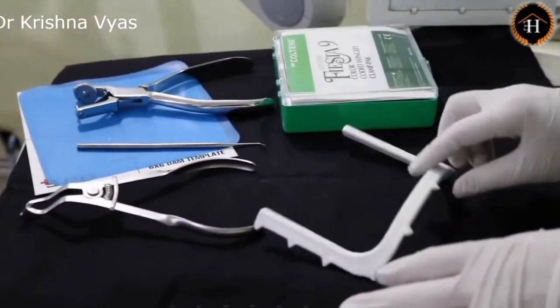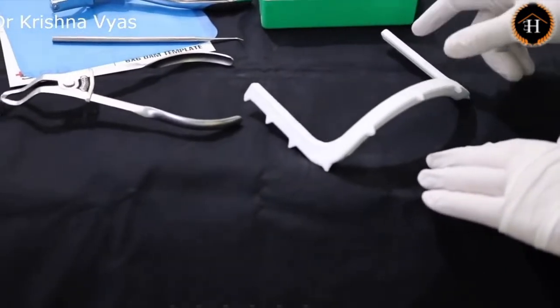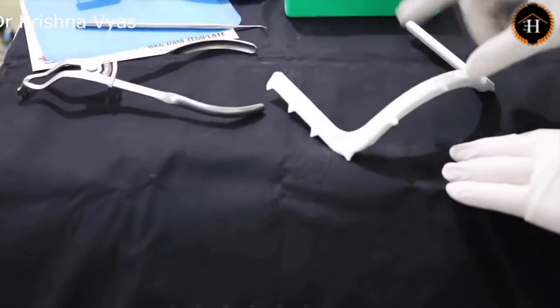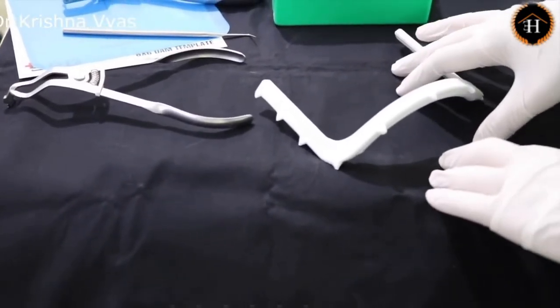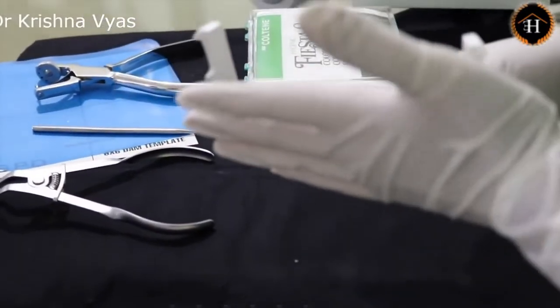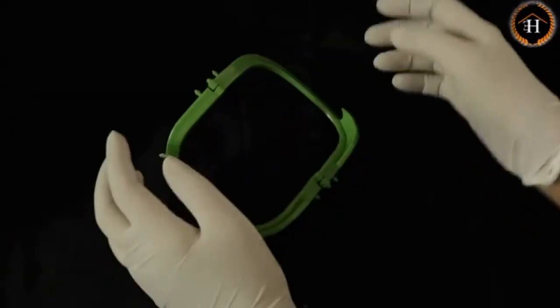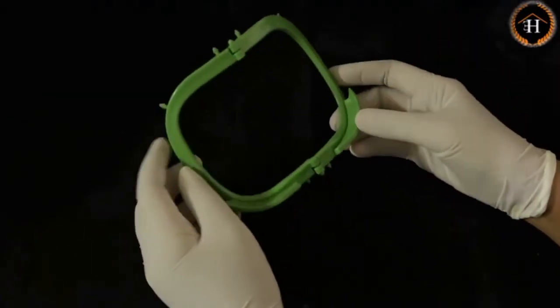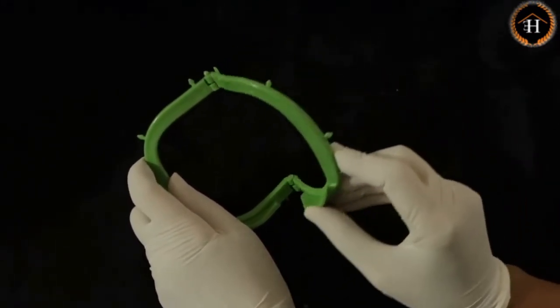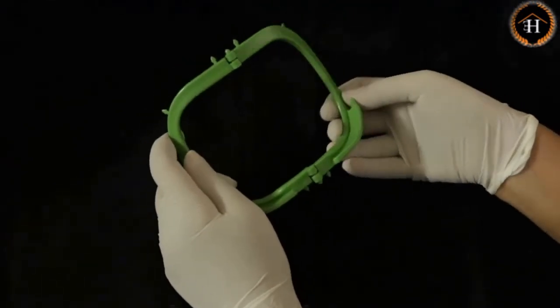The frame comes in two types: one is metal and the other is plastic. One advantage with the plastic one is that you need not remove it while taking radiographs, as it does not appear radio-opaque. Once you place the rubber dam sheet, the frame is used to stabilize it in the patient's mouth. The plastic one is also available as a foldable frame, so when it is in position and you need to take a radiograph, you can simply fold it and take the radiograph without removing it.